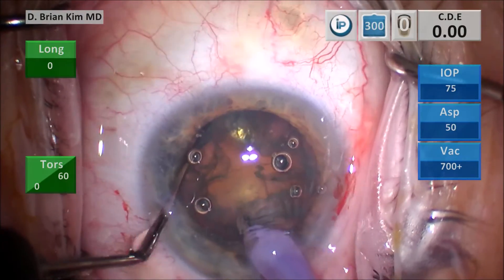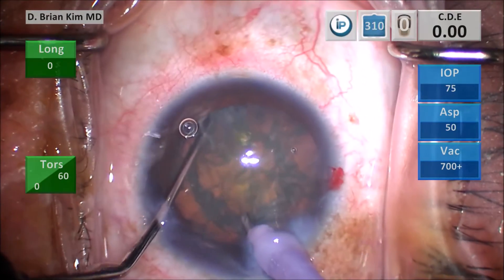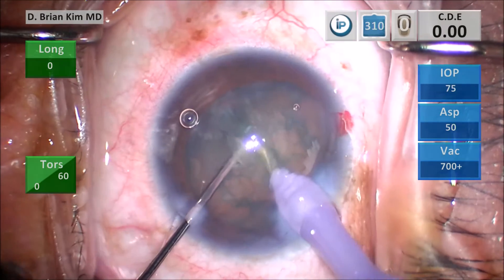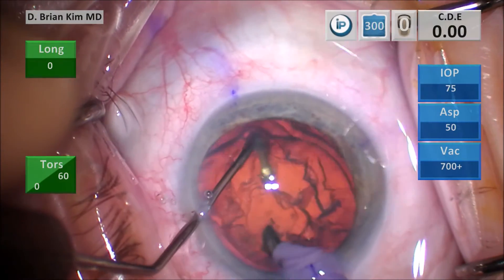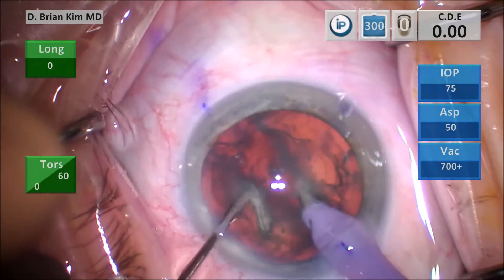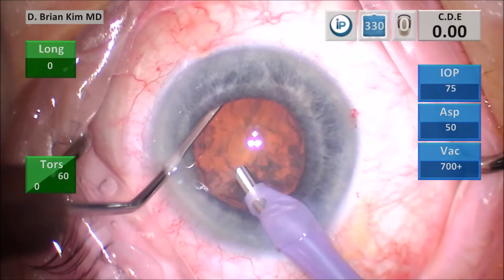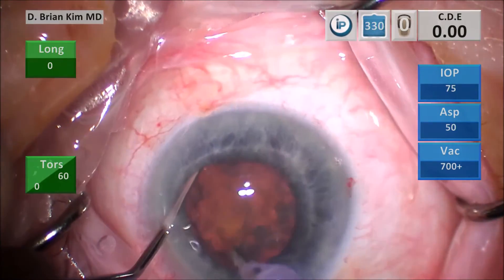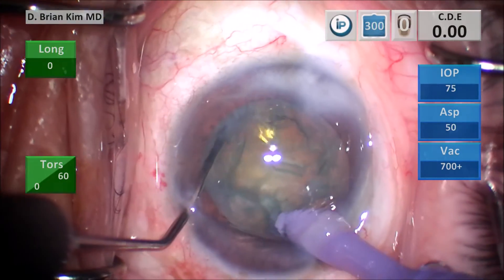Because it happens rather quickly in the eye, it's difficult to really ascertain what's happening. I am first lifting the lens — hopefully you'll be able to appreciate that — supporting it from below, and then stabbing the lens with the facotip, pushing down as I'm lifting up with the chopper. This causes no zonular stress. For those concerned about zonular damage or pushing down on the lens, I hope this illustrates the point very clearly. Please bear in mind that bringing the instruments together simultaneously is the best way to do this technique — I'm only showing this sequentially for illustrative purposes.